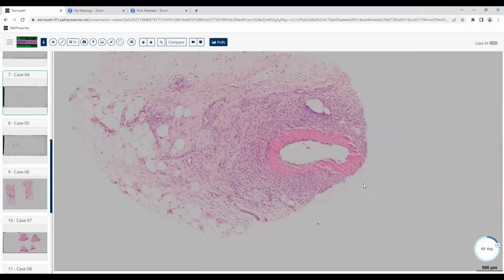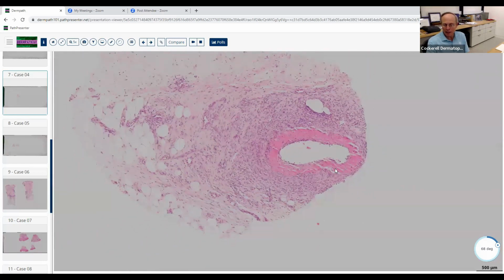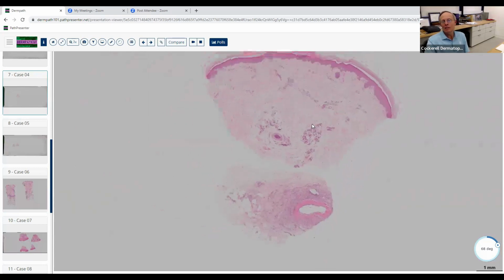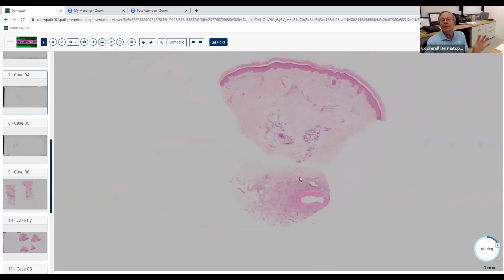I guess if we're thinking this is a vein, you could think about thrombophlebitis. Good. Migratory thrombophlebitis or thrombophlebitis. So that can look histologically virtually identical to PAN, but it's a vein instead of an artery like this was. And sometimes we'll actually even do an elastic tissue stain to see if there's an internal elastic lamina. We don't usually do that. Usually the clinical picture is pretty obvious. This was PAN in this patient. They knew it fit the clinical; it was pretty classic. It wasn't just a vein on their calf that was thrombosed.